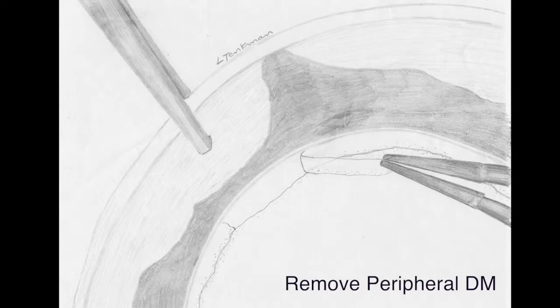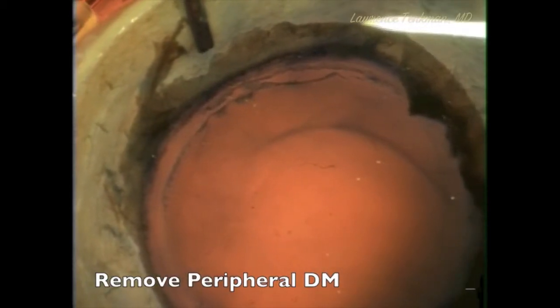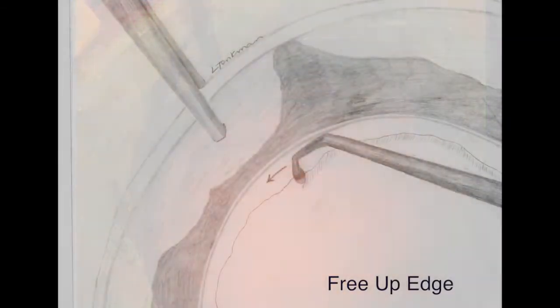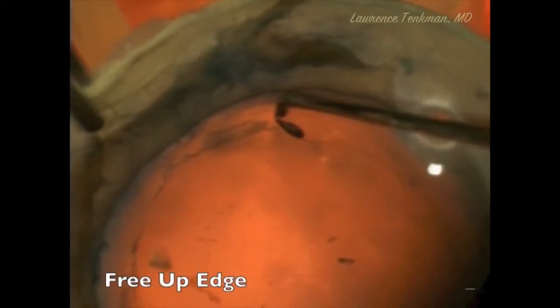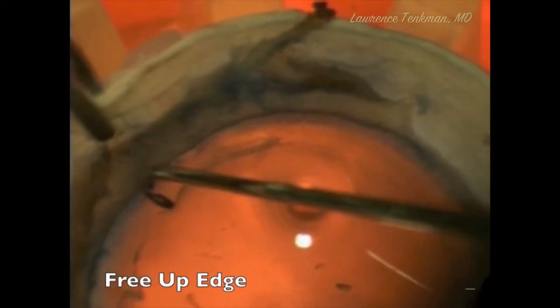The next step is to remove the peripheral Descemet's Membrane. When it comes off in one piece, the reason we remove this membrane is so that we can see the edge and free it up. We free up the edge of Descemet's all the way around for 360 degrees so that we have an edge to grab and peel.